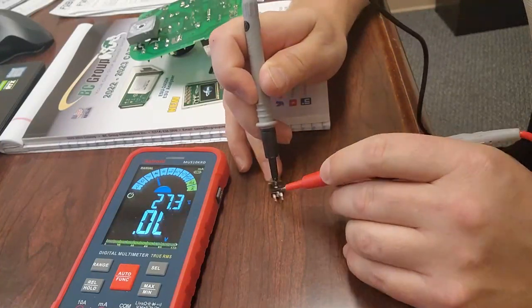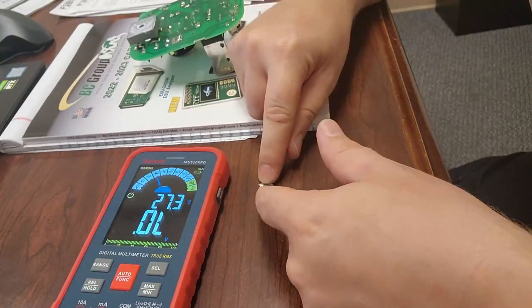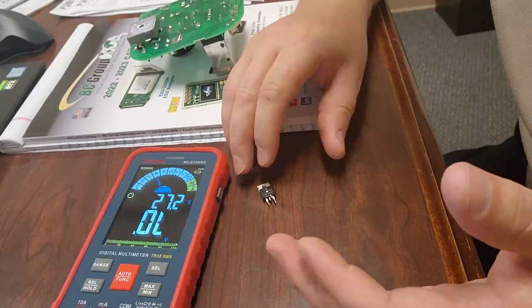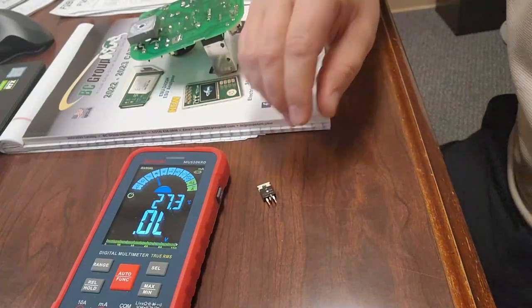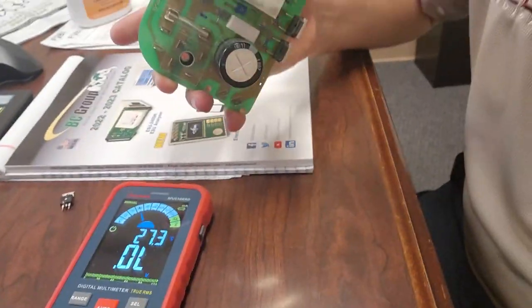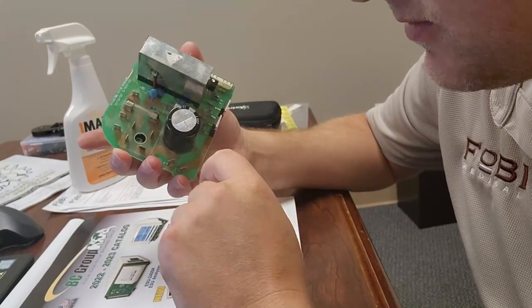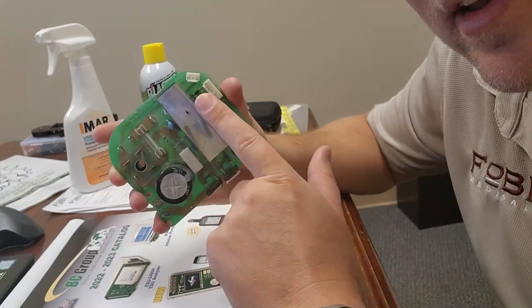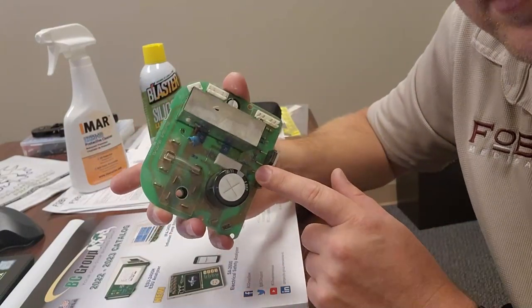Inverse, dead short. So because these are two identical diodes facing each other, one of them is shorted, the other one's functional, which is why I had voltage at the terminals, but at the same time, it was shorted. So I had voltage, that's why I got the arc and spark in the video, but one leg was shorted. And what I imagine is that this power supply here probably has a short detection, and it's probably limiting these SCRs. As soon as that short was detected, it's probably by the brain box, it would have to have some sort of short detection, because otherwise these guys here would just go up in flames.